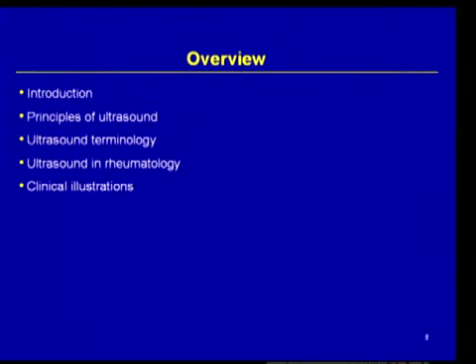In this part of the DVD series, I will introduce you and review some of the musculoskeletal anatomy. I will give you an introduction about the use of ultrasound in medicine, some of the principles of how ultrasound can be applied to looking at clinical illustrations. Key to understanding ultrasound is actually knowing the terminology, and that I will review with you as well. I will show you some specific illustrations for rheumatology and a number of different clinical illustrations.